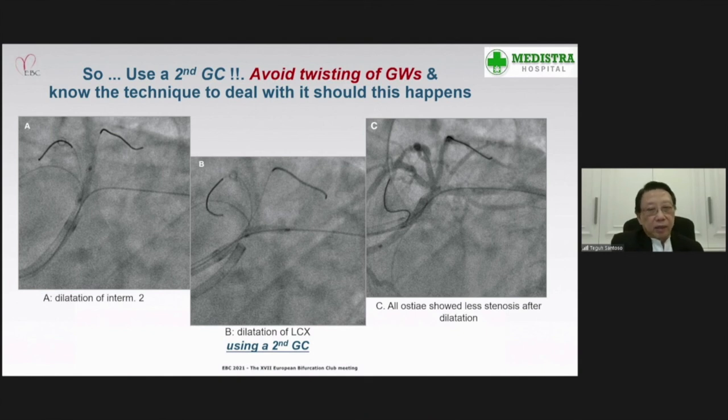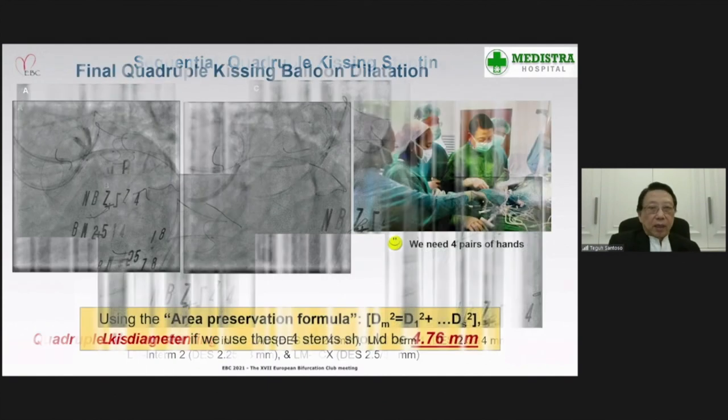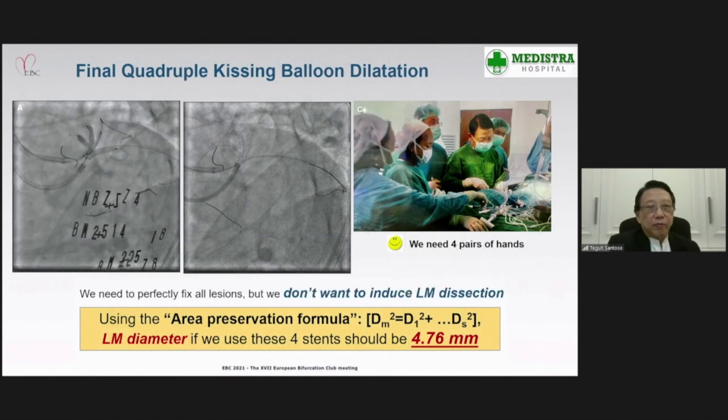So then we dilated the two other side branch ostia. And this is just to show the all-clear less stenosis after balloon dilatations. And following this, we did a sequential quadruple stenting in all the side branches as shown here. And this was followed by final quadruple balloon dilatation. And we obtained a very acceptable result as shown here.